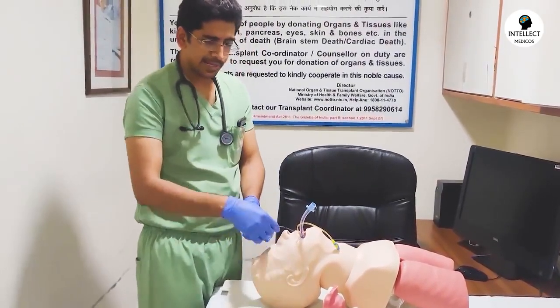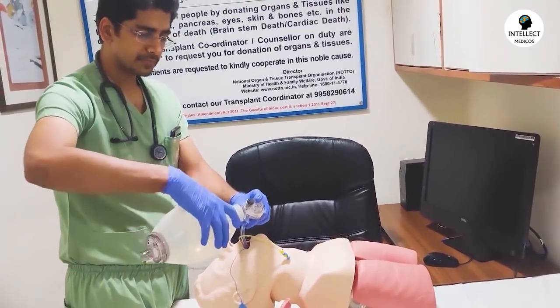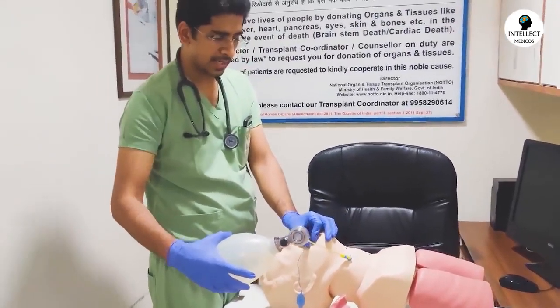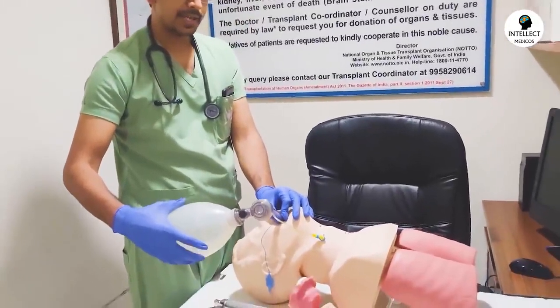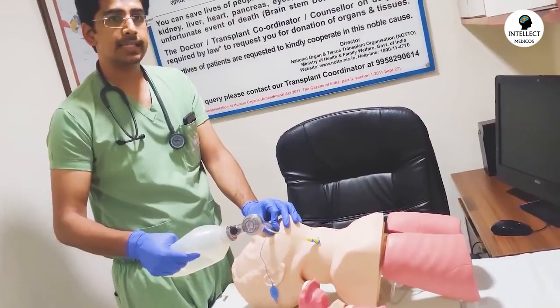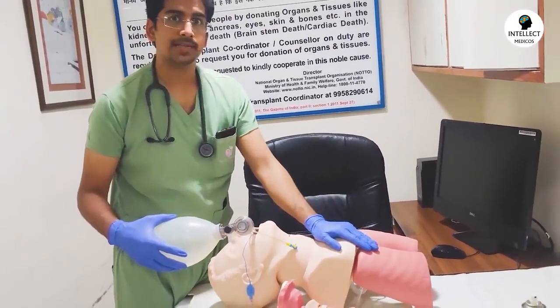Now after this, we need to inflate the cuff of the endotracheal tube and attach the resuscitation bag. You should hold the endotracheal tube from the angle of the mouth, from this point, so that it doesn't slide inside. Now, yeah, so we can ventilate the patient. You can see the inflation of the lung. That means this endotracheal tube is inside the trachea of the patient. Had it been in the esophagus, then you would not have got the appropriate chest rise.